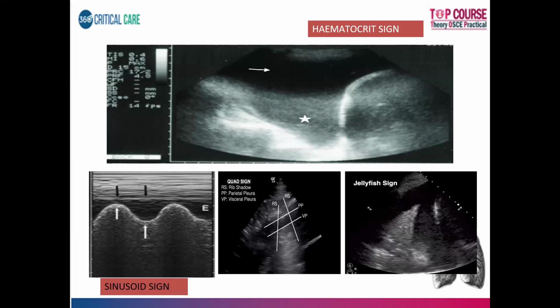So what we usually use is the Balix formula, which is very commonly used. Usually the patient needs to be supine, and the head end elevation should be roughly around 15 to 30 degrees. The patient is placed at that position. At end expiration, you need to place the probe cephalocaudad, perpendicular to the dorsolateral chest wall, and then you have a measurement between the visceral pleura and the parietal pleura.